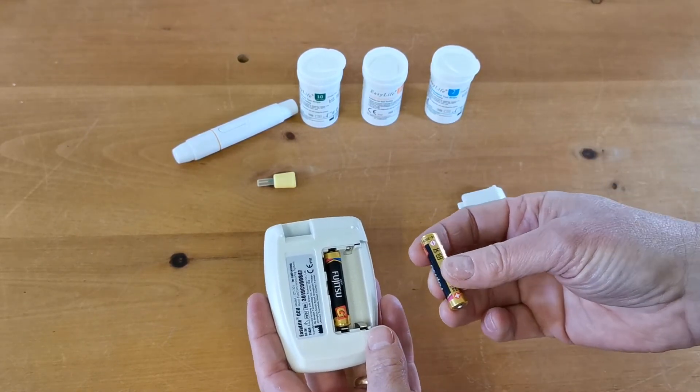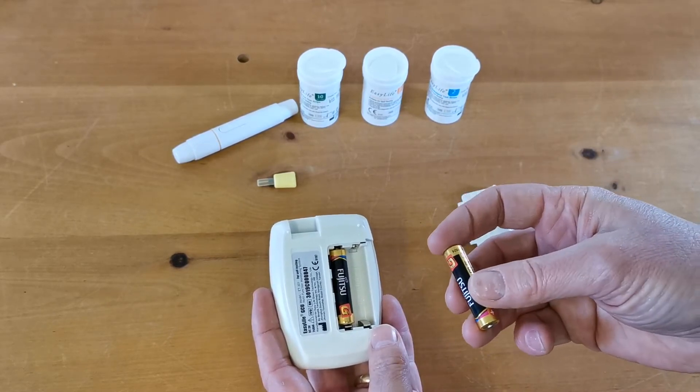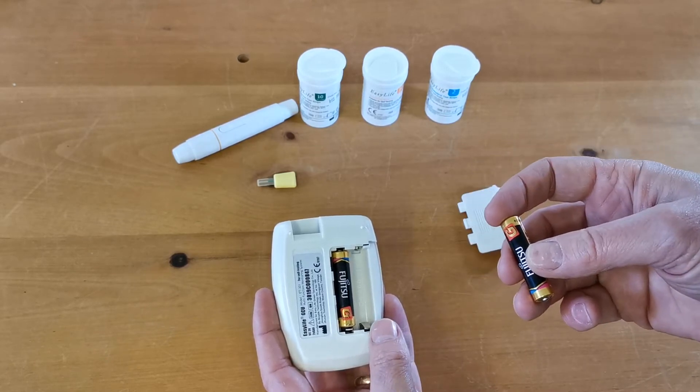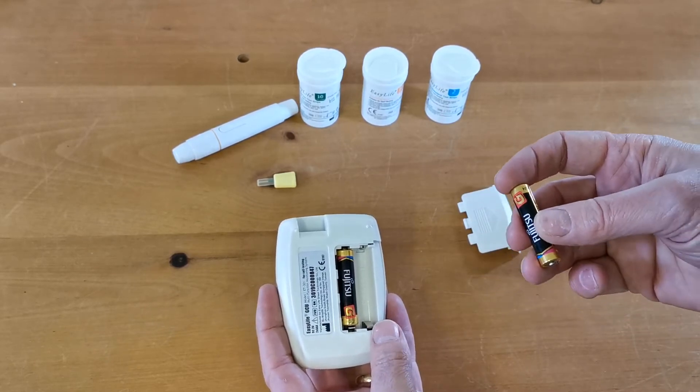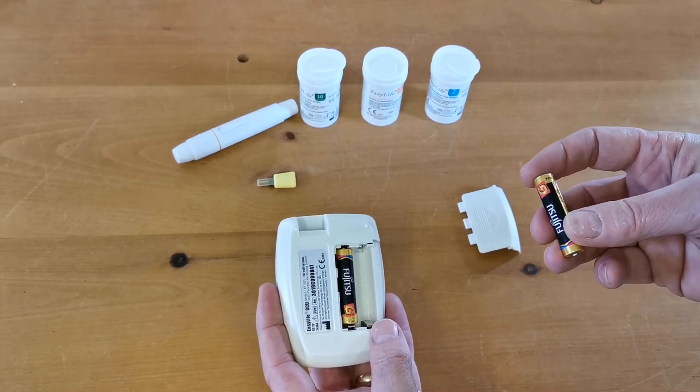Just before I put the second battery in, I want you to be aware that you've got only a five second time portal to switch the meter over and start setting the time and date. So be prepared to do that and read the instructions about which buttons you're going to have to press.